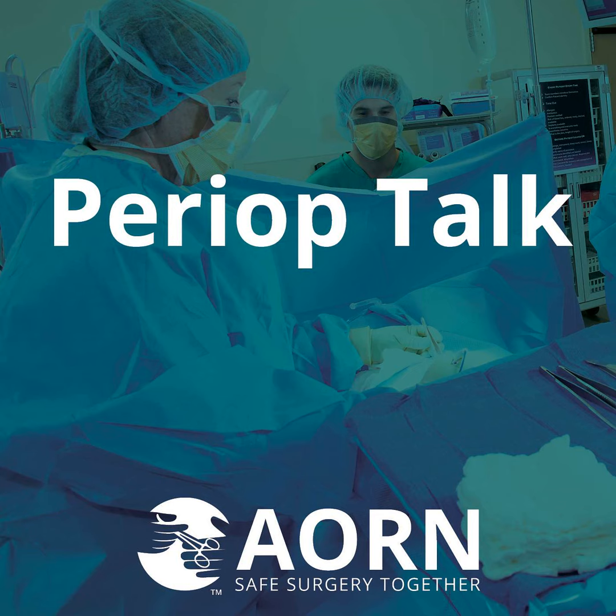Well, we want to prevent infections and we want to make sure that we are protecting the integrity of those sterilized contents that we work so hard to achieve sterilization. And we want to make sure that we maintain that until it's time to use those instruments. Yeah, I think this is a really important topic for periop nurses because I don't think we always understand what goes into packaging for sterilization and the different nuances of that. So, what are the most significant changes that you made to the recommendations when we're selecting and using those materials?